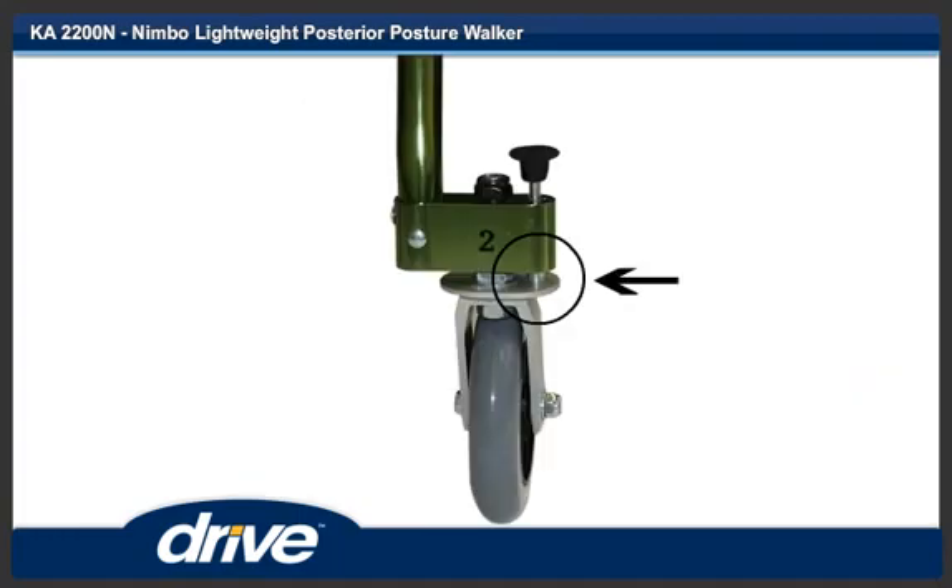Step 12. To lock the casters, do steps 10 and 11 on both casters. Manually turn the caster until the locking pin engages.